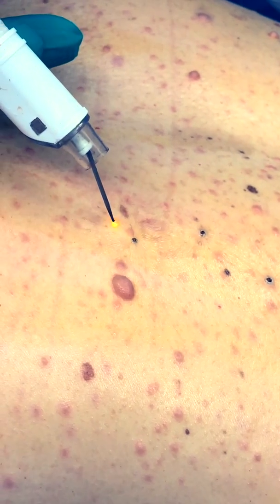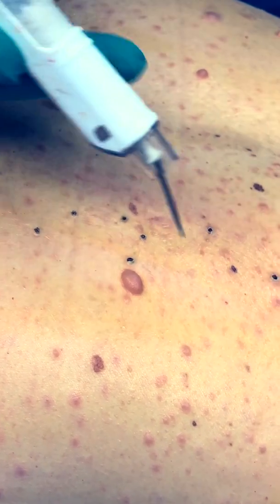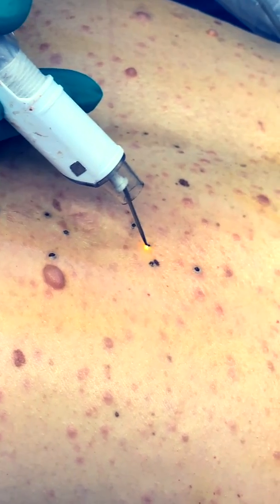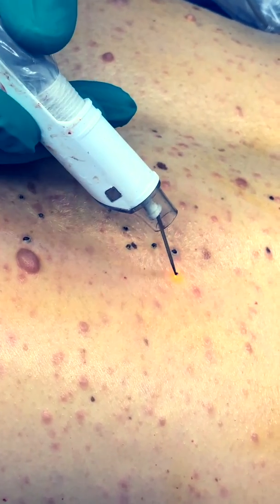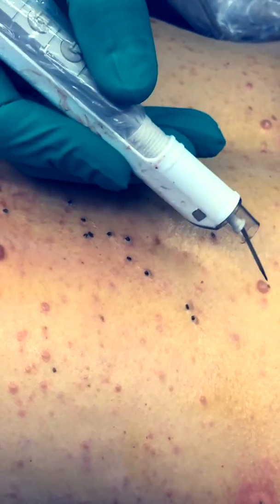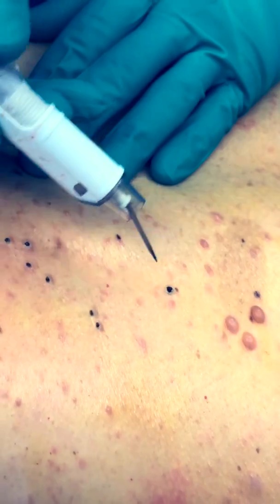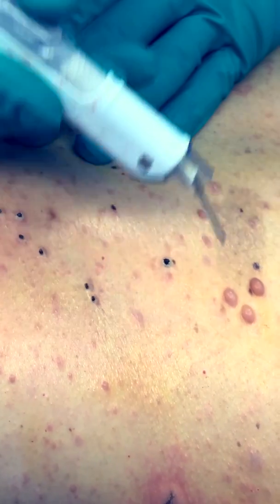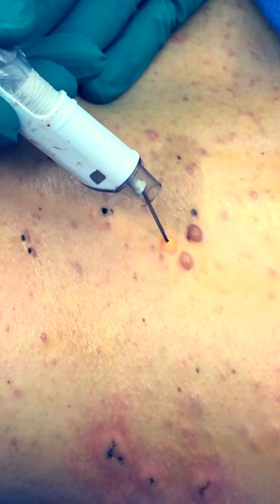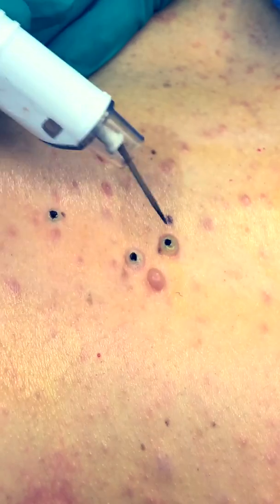I'm going pretty fast on the small ones, skipping some areas on purpose — that's the technique I've developed over the years. On larger bumps I stay a little bit longer and they go flat for now, but I want to check those later to see if they stay flat. Some are on the larger side and I may need to come back and cut those out.